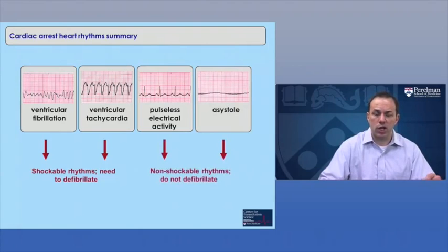These rhythms do not need a shock. So with this one slide, I've taught you one of the most fundamentally important things about using defibrillators, the identification of the right rhythm that needs a shock or does not need a shock.